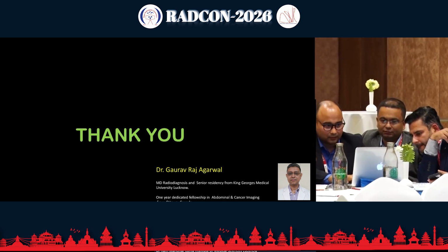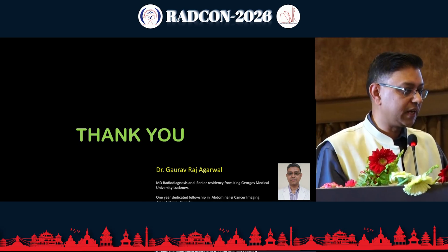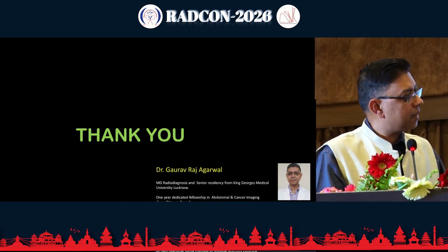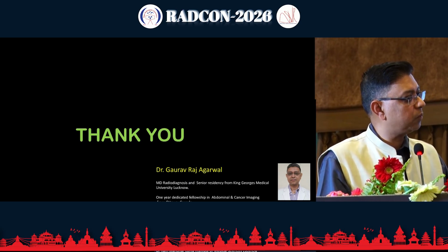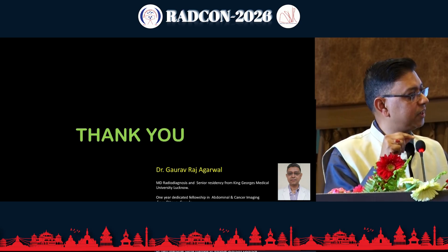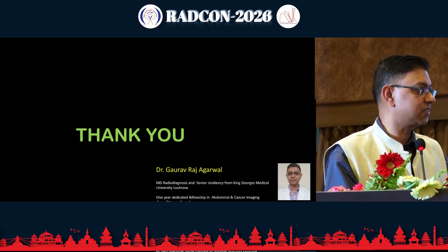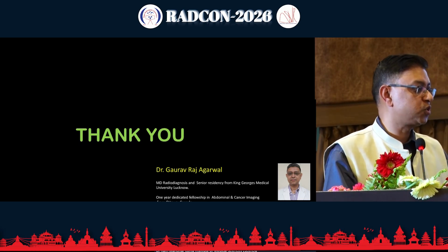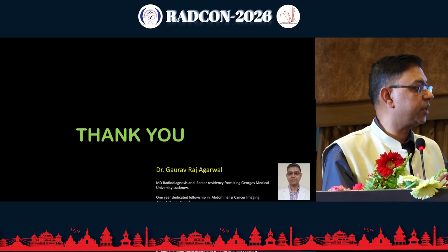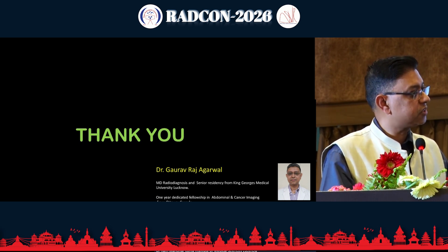It depends where you are. If you are in a private practice where the patient can afford it, it's good. Please send him or her for an MRI. But in day-to-day practice, it becomes difficult to get an MRI done, and we rely more on CT scan. I would rather put in a needle. I am more confident in putting in a needle, taking out the sample and telling the surgeon directly what the lesion is. That is one thing. We usually keep MR reserved to see communication with the duct. That is the question the surgeon usually asks, whether it's communicating, and for follow-ups, where we don't need to give contrast.